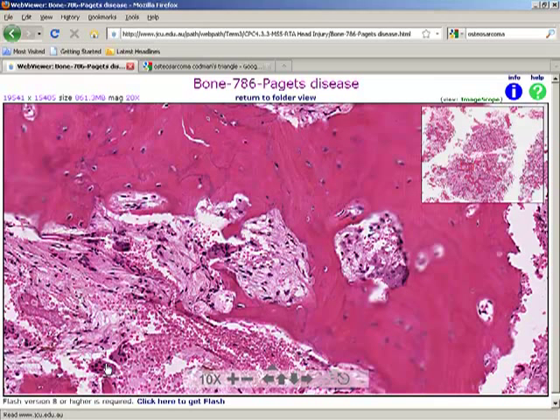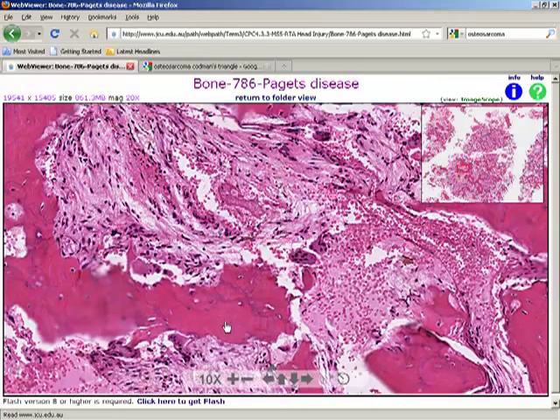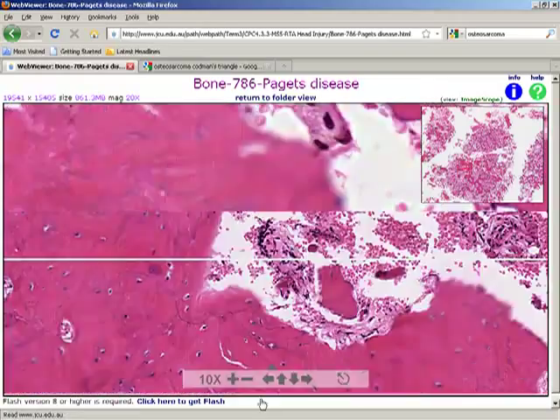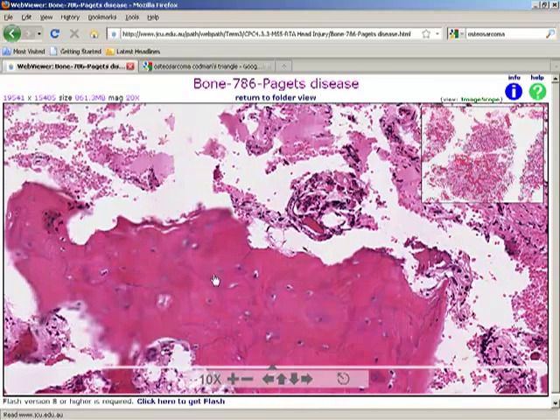That's an osteoclast, this is an osteoclast. Plenty of osteoclasts. And you can see that osteoclasts are eating away the bone. And also there is deposition because there are increased osteoblasts also. Plenty of osteoclasts, plenty of osteoblasts, and woven bone everywhere. So, it's just like a fracture occurring everywhere, but it's not really a fracture.